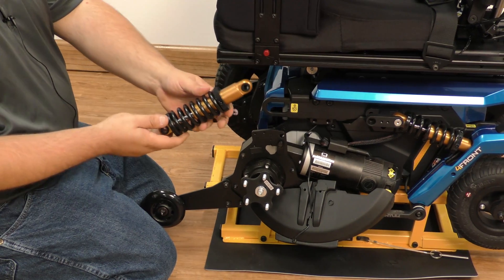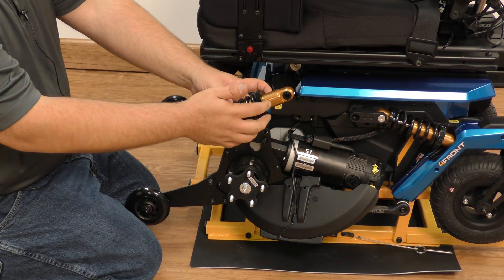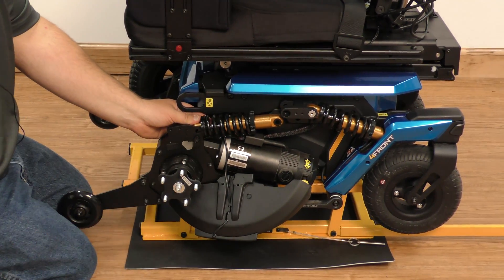Now to replace our strut, you want to make sure that the threads are pointing towards the back of the power chair. Then we put our strut in.